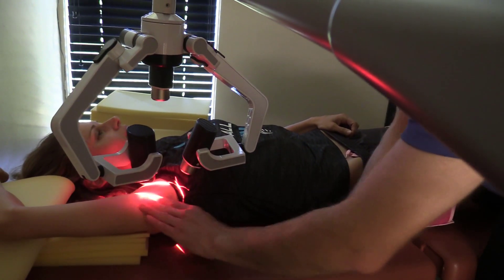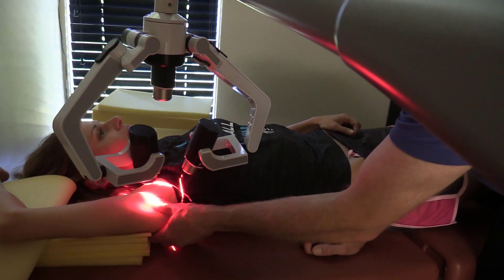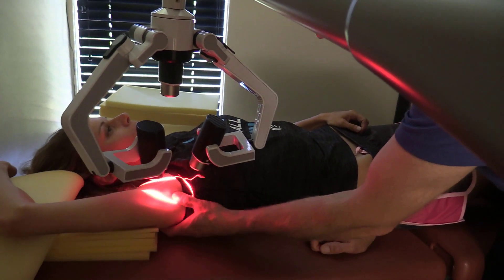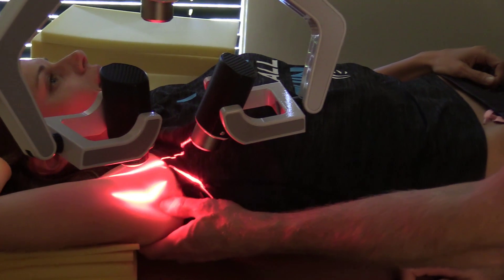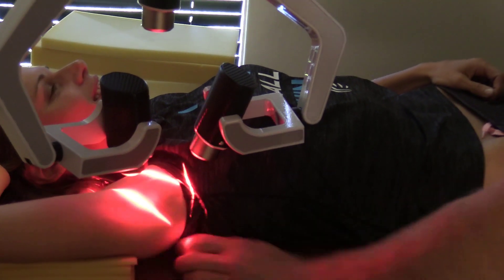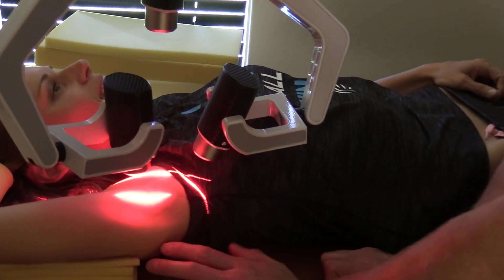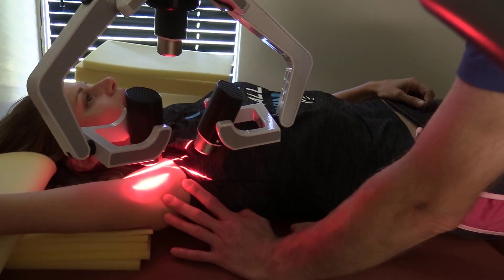When you're coming up here, the subscap and a whole bunch of different muscles insert here — latissimus dorsi and subscap are the two biggies. She's just hard right here and you can see me rolling over that big ropey muscle there. That shouldn't happen; that should all be soft and squishy and flexible. When I test these things, I like to have a slight stretch on the muscle. I don't have to have it cranked up, but with a slight stretch you can find the problems.